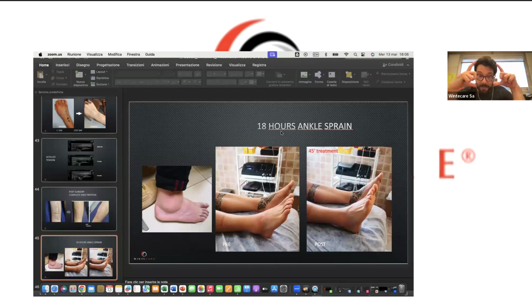Thermal increase, biggest electrode from 1 to 1.5 ampere, thermal effect. When this is achieved, when we feel that the range of the movement is improved by several degrees, it would be easier for him to perform a stretching.